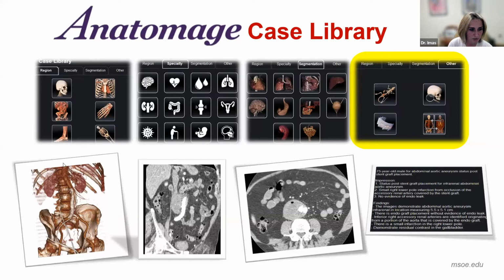But you can also enable the presentation of the original CT images, as they were taken. You can certainly change your orientations from axial to sagittal to coronal to oblique views, and you can visualize the anatomy in a more traditional sense, as radiologists typically would. As I said earlier, many of these cases come with detailed clinical history. So here I just have a little blurb from an otherwise much longer clinical history, which would essentially include notes on the patient made during this evaluation.